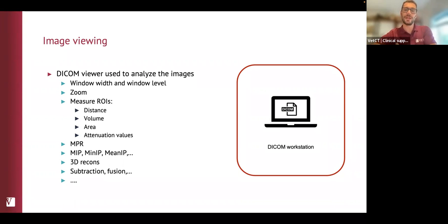There's lots of other things we do. We interact with images a lot when we report CT: changing the angles, doing 3D recons, measuring volumes, areas, distances, zooming into the image, subtraction. There's a lot of manipulation that we do, but that's not really relevant for the conversation today.